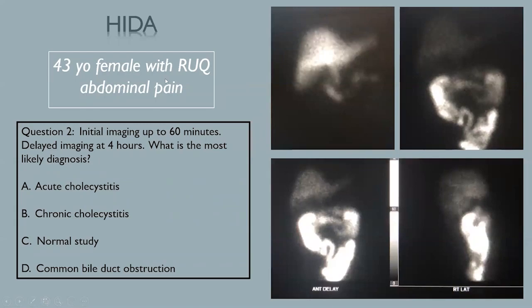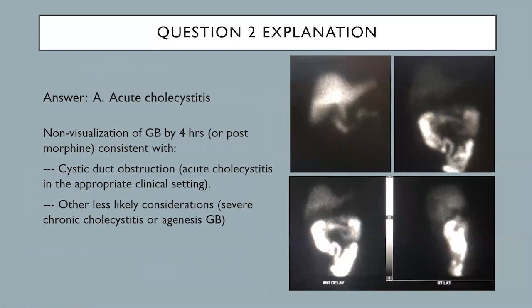This is a 43-year-old female with right upper quadrant abdominal pain. Initial 60 minutes of imaging shows radiotracer in the liver with excretion into the common bile duct and small bowel. However, gallbladder is not seen — radiotracer activity is not seen in the gallbladder. Delayed imaging again shows no radiotracer activity in the gallbladder, compatible with acute cholecystitis.